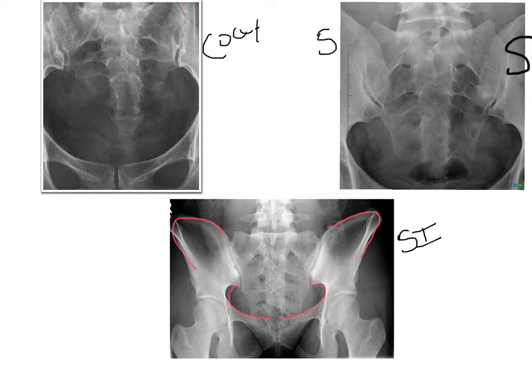And notice the different shape yet again on this AP axial from this pelvic brim and from the AP axial coccyx pelvic brim. It is even more squatty and closed. And if you look at the position of the sacrum, it does fill that pelvic brim, but it is now superimposed by the pubis symphysis. And this is what we want for AP Axial SI joints.